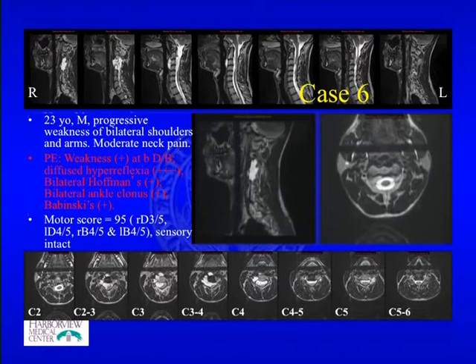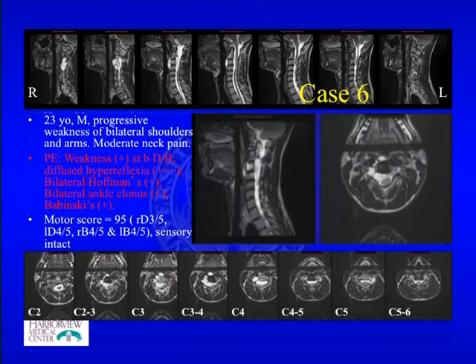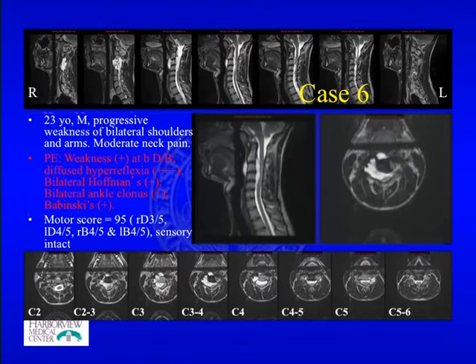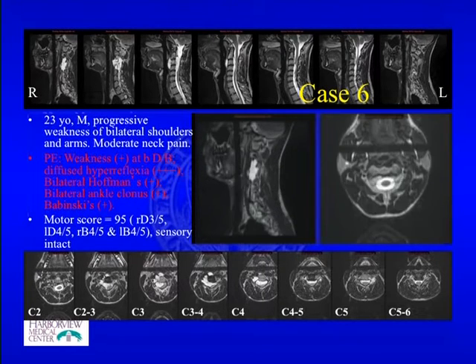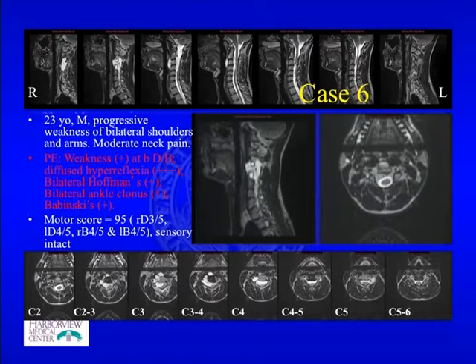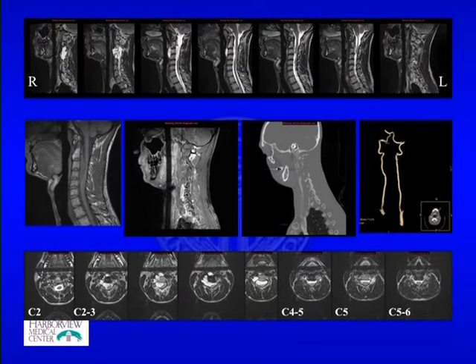This is the imaging study we got. The MRI scan shows a lesion in the cervical spine. It's a high signal on T2 and wraps around one side of the vertebral artery as well, with cord compression. Further workup shows it on T1 as a low or iso intensity, with very mild peripheral enhancing with the contrast. The CT scan doesn't show much bony erosion, but it has some scalloping into it with a sclerotic margin. And we got a CTA, which shows a bilateral dominant vert.